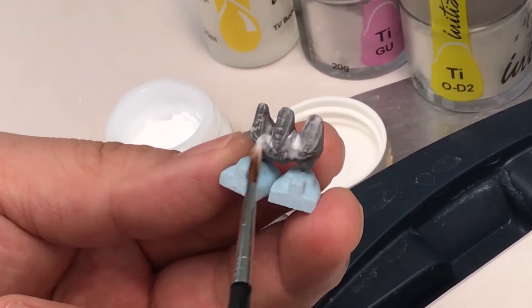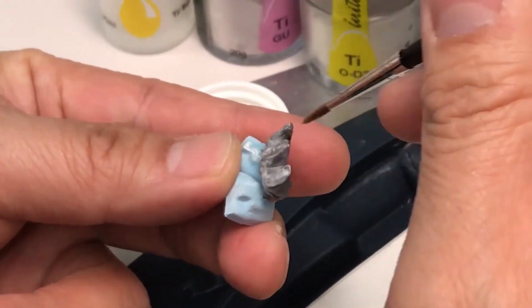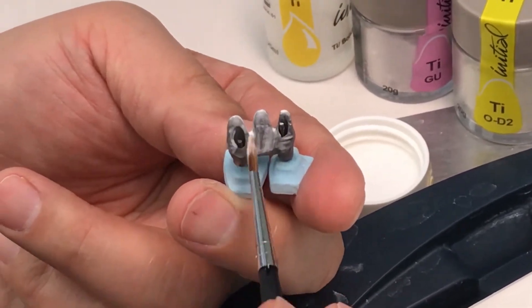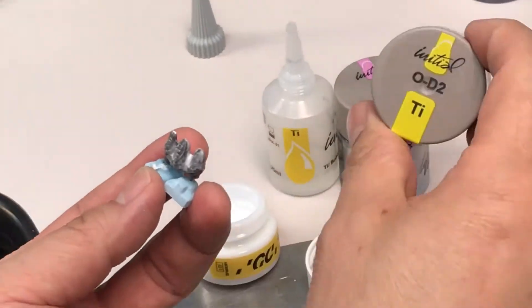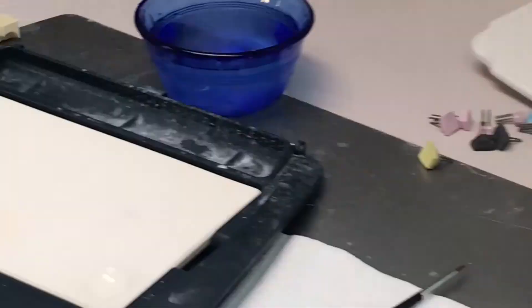Now it's ready to apply GC Titanium Bonder. It doesn't need to be too thick. Then we bake it at 800 degrees Celsius in the Ibex oven.